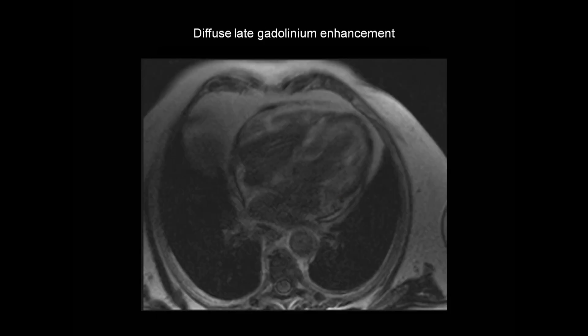When we perform late gadolinium enhancement imaging, we see the diffuse distribution of late gadolinium enhancement in the myocardium, as a consequence of the cardiac amyloid deposition.